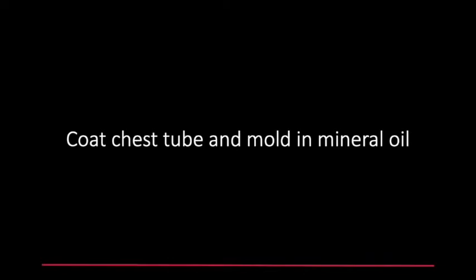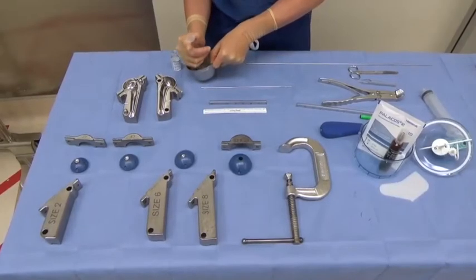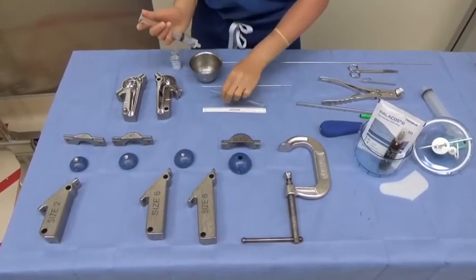Then, coat the inside of the chest tube as well as both halves of the mold with mineral oil.